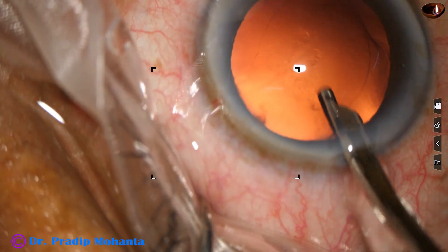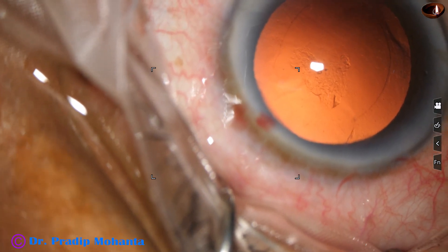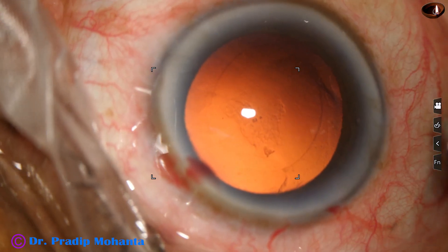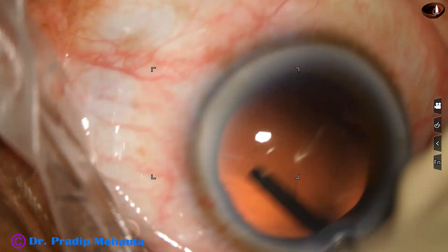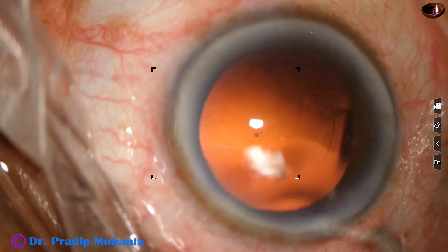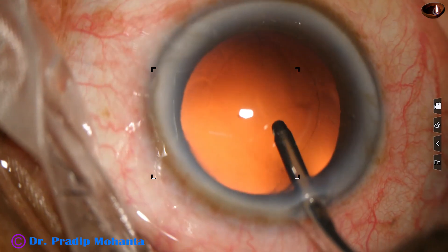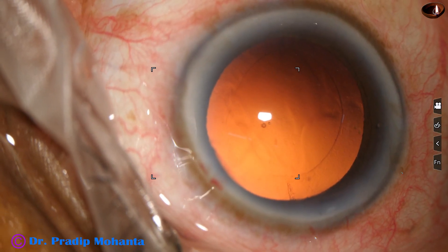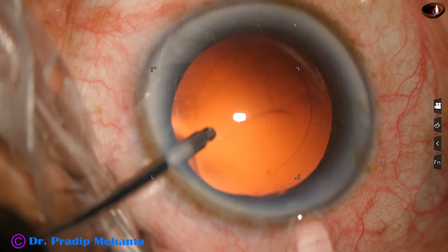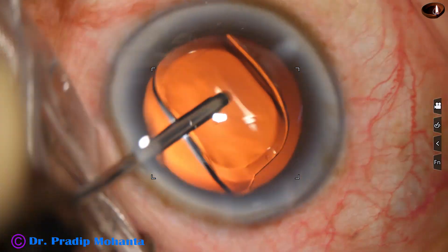We can see a patch of cells on the posterior capsule. I tried to remove it with the Simcoe but could not. So I take the irrigating cannula and use the irrigating jet of fluid to dislodge it. The irrigating jet of fluid dislodges the cells — the patch of cells sticking to the posterior capsule — and a nice polishing of the posterior capsule is done just by the irrigating fluid. No vacuum is used for polishing, thus avoiding posterior capsule rent after emulsification and removal of the cortex.